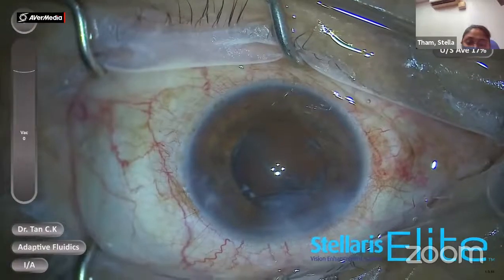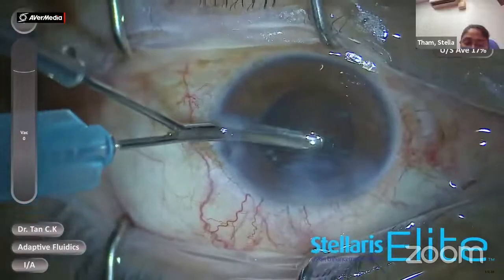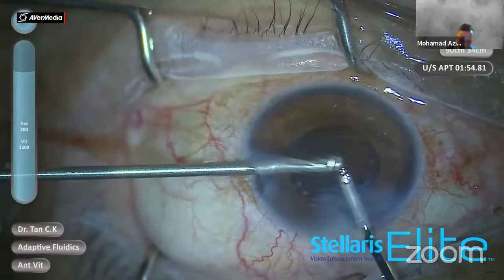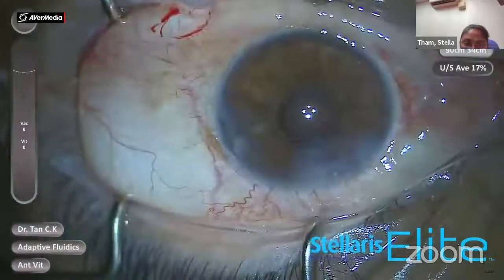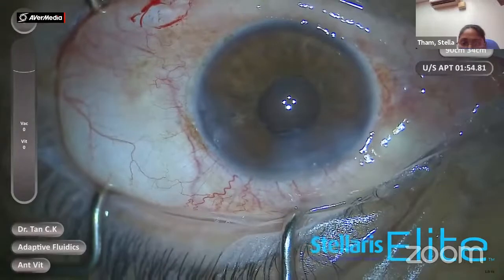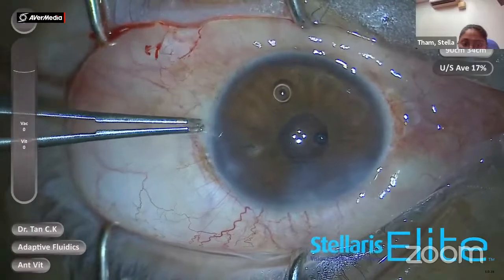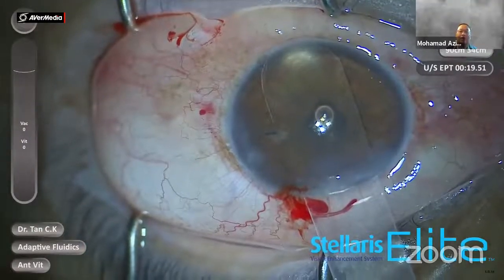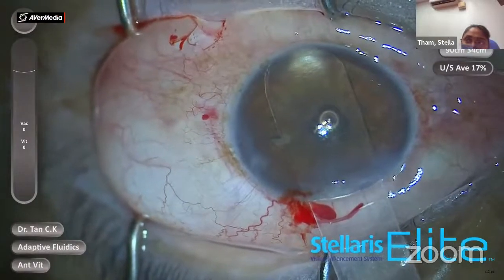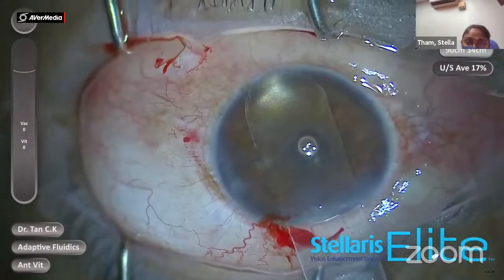Okay, doctor. After that, we proceeded with removing the cortex, and there was no epinucleus drop, and then we injected Miostat. The pupil became well round and smaller. There is no vitreous in the AC. Then we proceeded with insertion of the ACIOL. Explain to us why not sulcus. We did not proceed with a sulcus lens in view of the large PC rent, which was from 2 to 7 o'clock, and the bag is not stable.